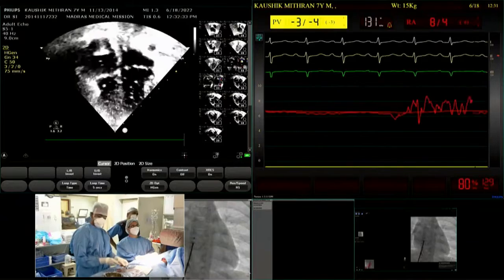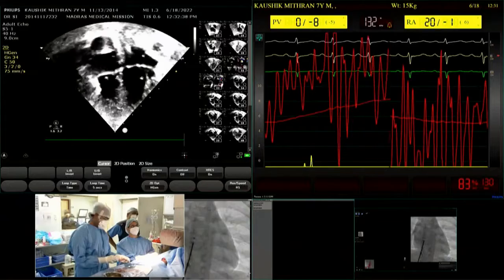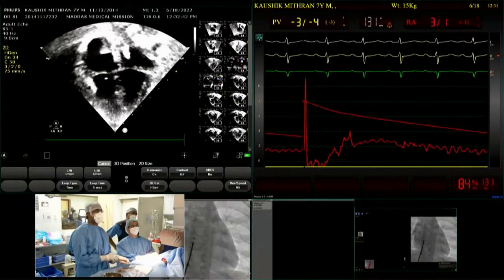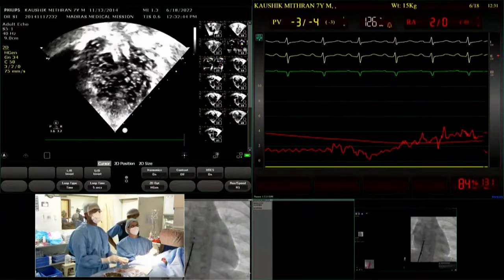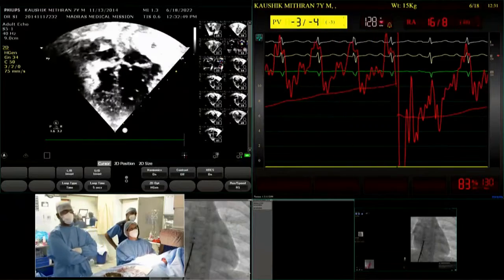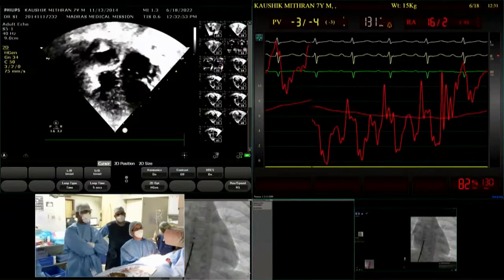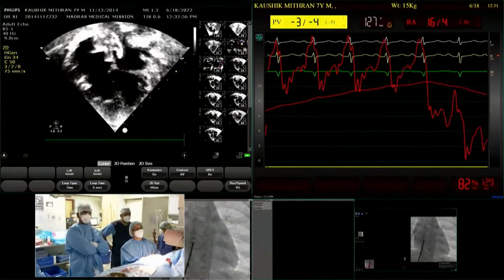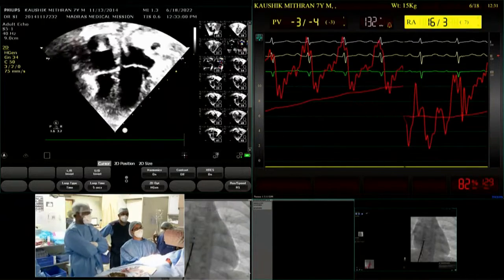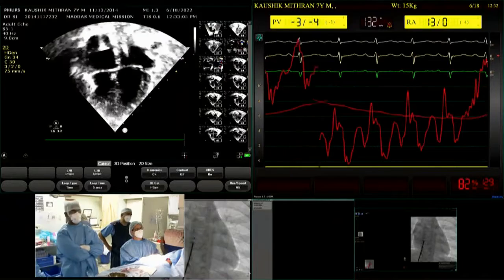Yeah, I agree with you. I think what Shiva is planning to do is let us close the defect, whatever the maximum possible, we'll close it. Because the saturation, not saturation, the hemodynamics did not increase afterwards. Probably that is what in mind. Because the right ventricle appears reasonable, even though borderline, the tricuspid Z-score is more than minus 1.5, 0.25. So it's purely a diastolic dysfunction.